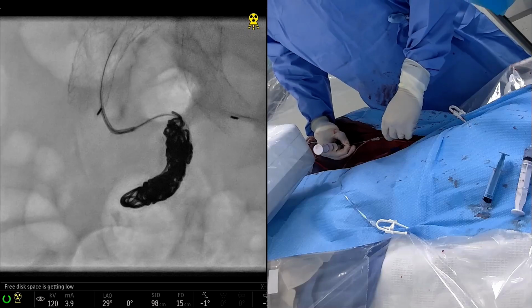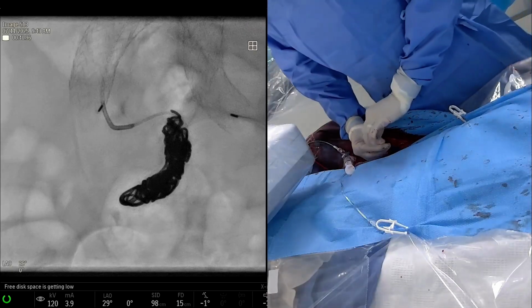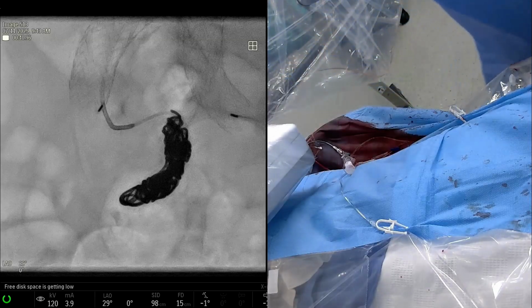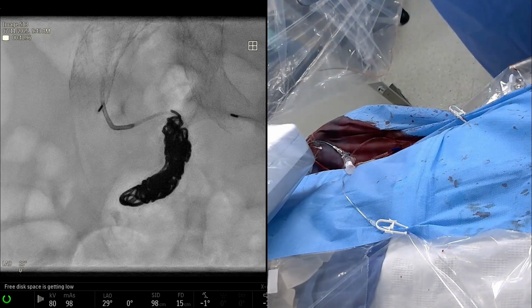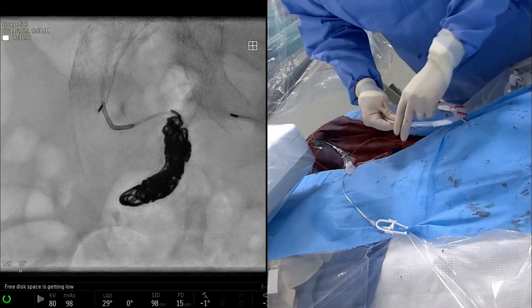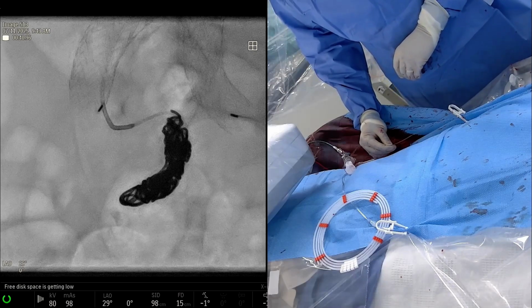So you can see there, we've buried the microcatheter. Yeah, now it's just going back out. Okay. The one thing I do like about the Lantern or the 2.8 ProGrate 150 is that it has the dual marker, so I don't have to see the tip of the microcatheter to know how far in. Exactly. So here we're going to take the smaller packing coil, the Penumbra 60 packing coil, and sort of the same idea. Go ahead. We'll just load this up. Yeah, keep going.